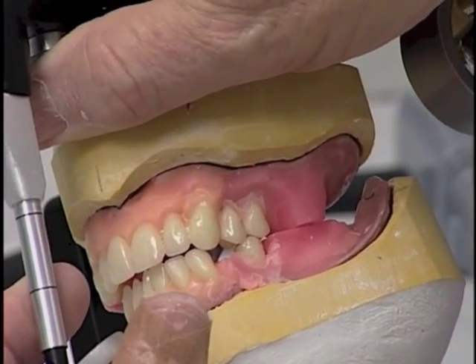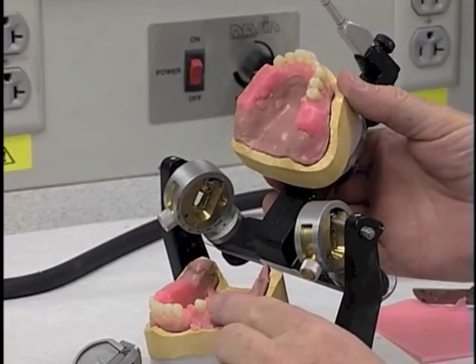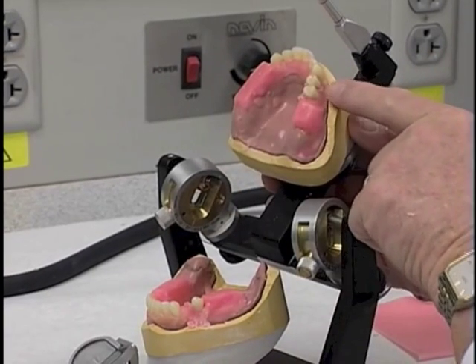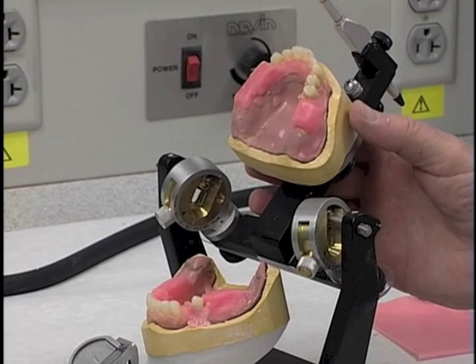Now from there, we have found the anterior-posterior position of a mandibular second premolar in relation to where a good aesthetic arrangement of the maxillary first and second premolars would be.